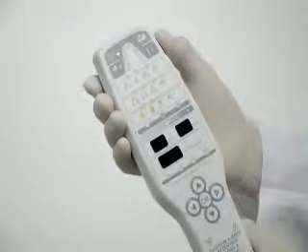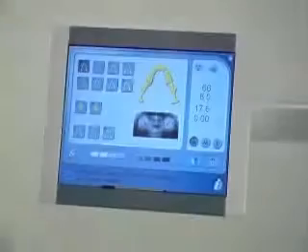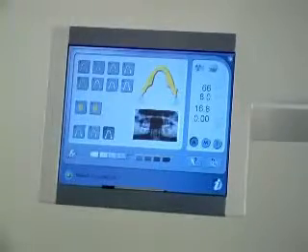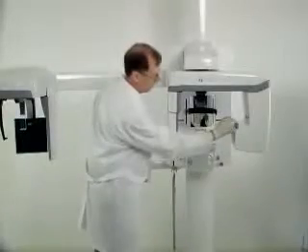Press the patient positioning button. Activate image capture and check that the unit is ready for exposure. Guide your patient into the unit. The patient needs to bite into their previous impression.